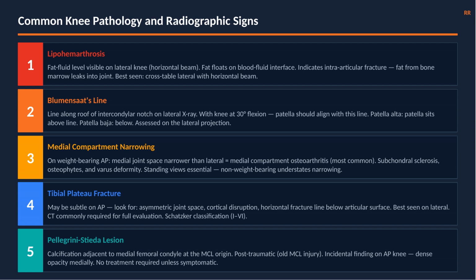Pellegrini-Stieda lesion. Calcification adjacent to the medial femoral condyle at the MCL origin. A post-traumatic finding after an old MCL injury. Incidental finding on the AP knee, dense opacity medially. No treatment required unless symptomatic.